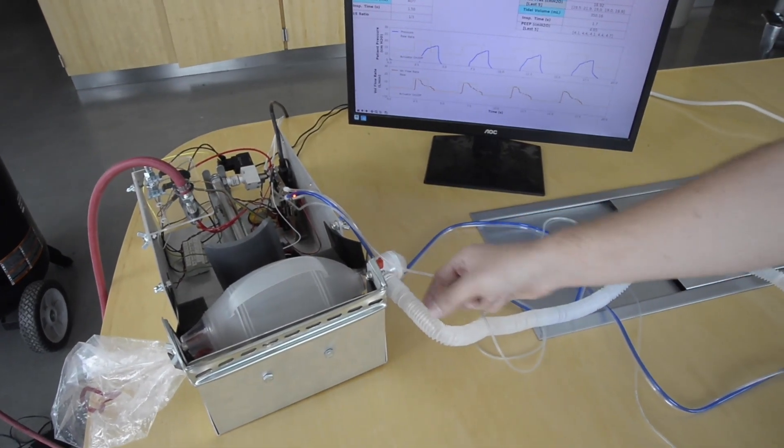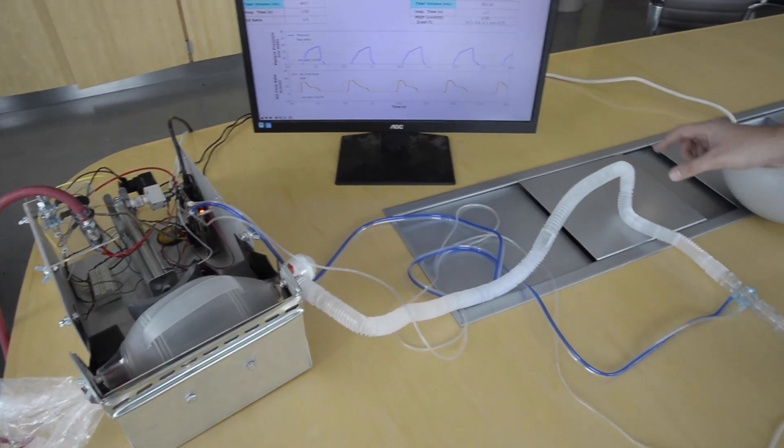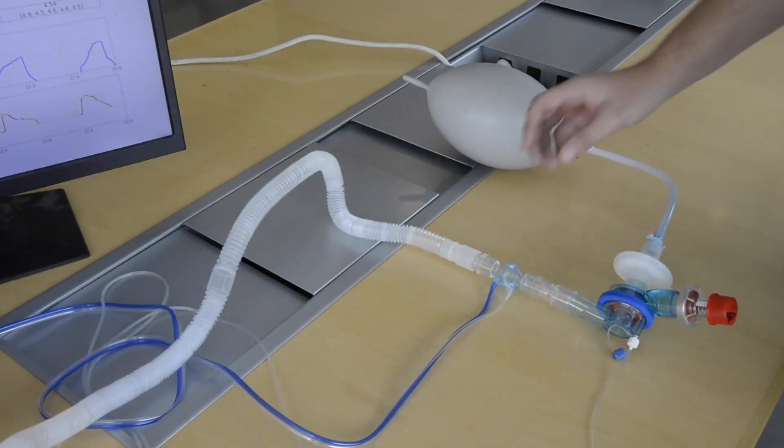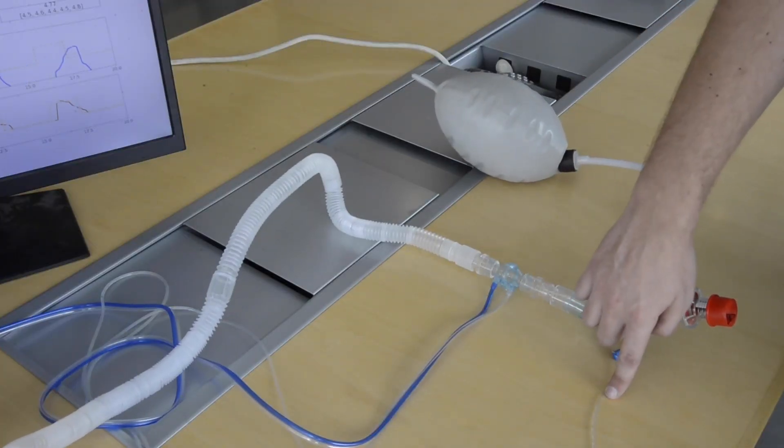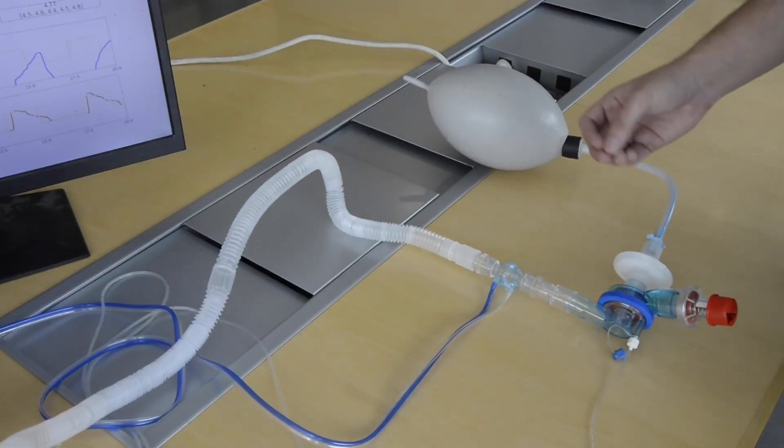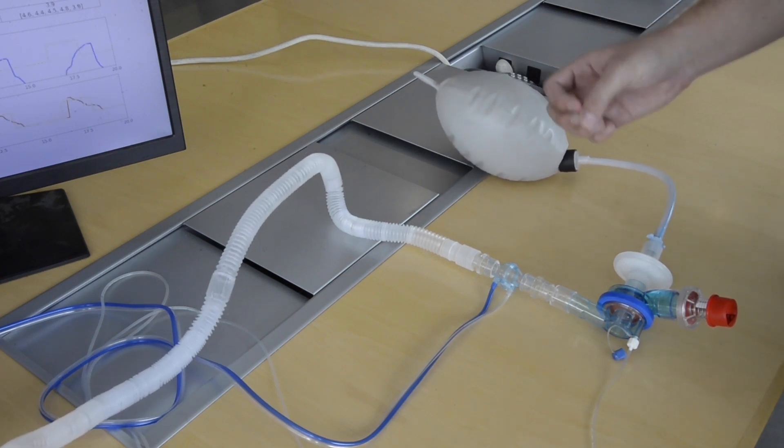Coming out of the ambu bag is a patient circuit flexible hose. On the patient side are a flow sensor and pressure sensor to continuously monitor patient vitals and update the Raspberry Pi.